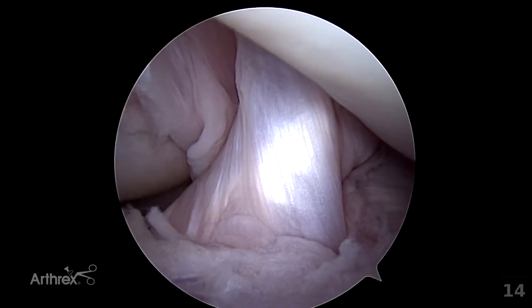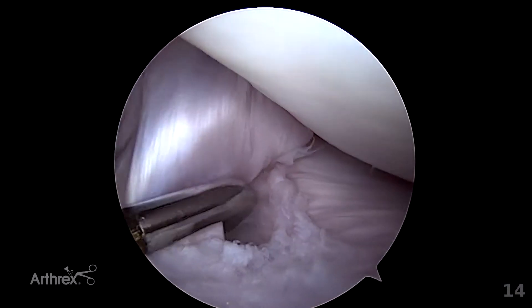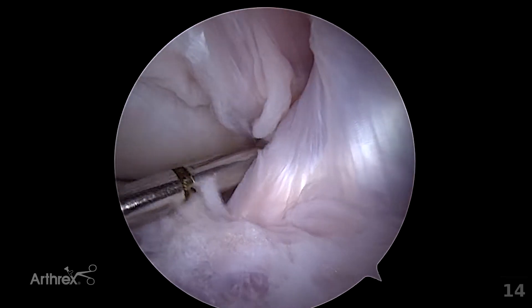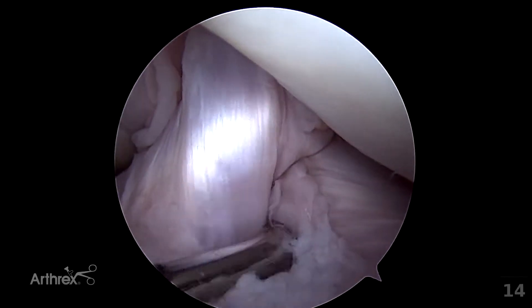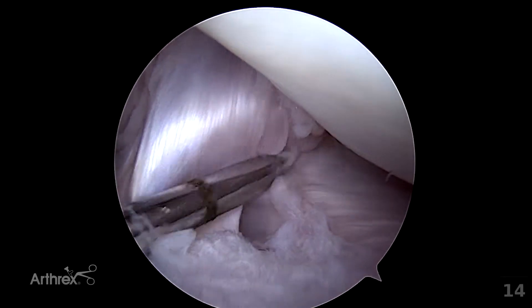In dogs with a partial cranial cruciate tear, the ligament will have damage that is not significant enough to warrant resection. The ligament may be left in these patients according to surgeon preference and judgment.